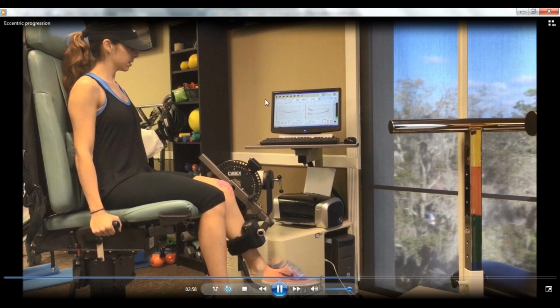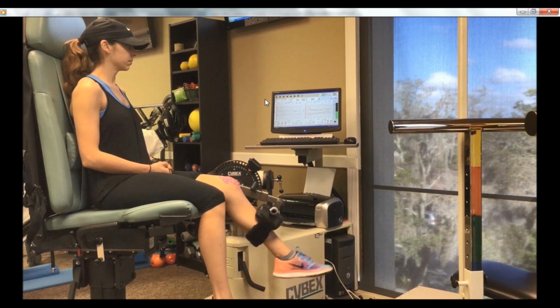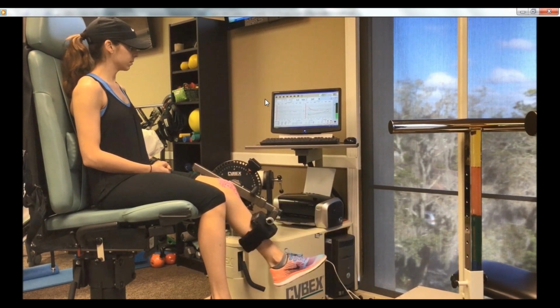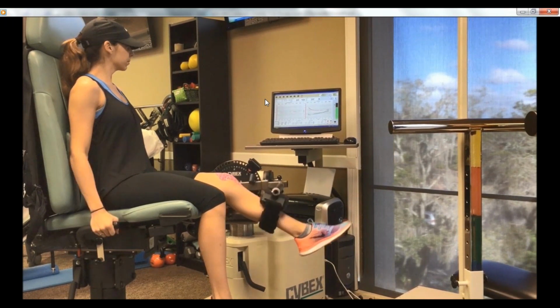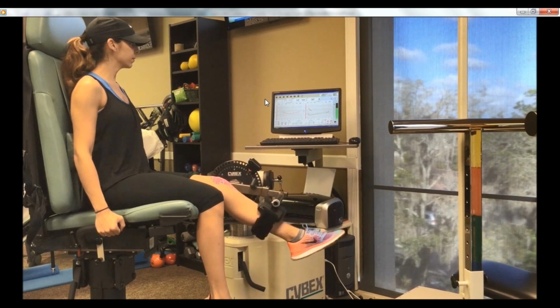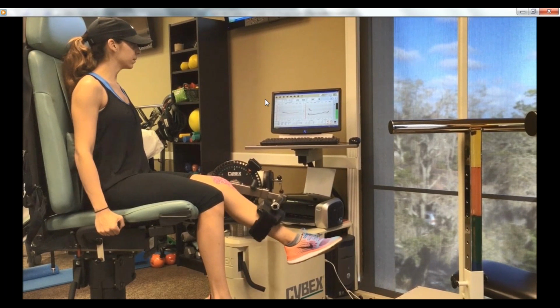So now we're getting even faster here. And you can tell she's wearing the same outfit. She has that same kinesio tape on the knee. So these were filmed actually within one session. You know, John likes to set 3 speeds in a set, and you do 10 reps of each in those progressive speeds. So this is the 3rd one of that set for that day for this patient.